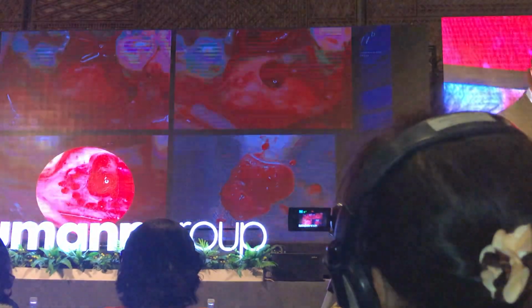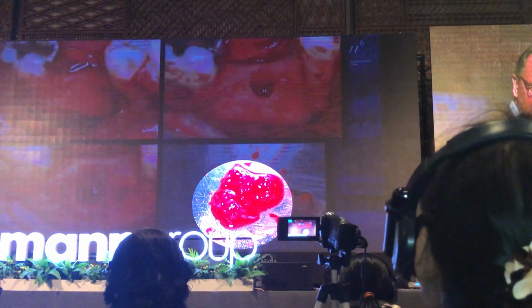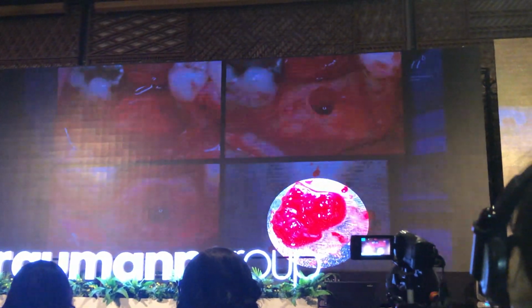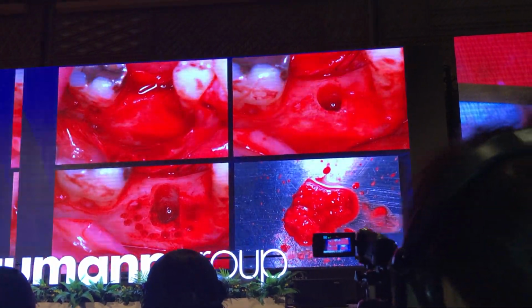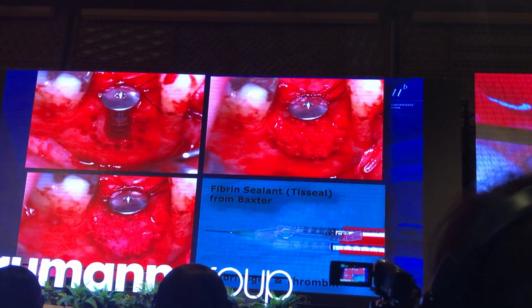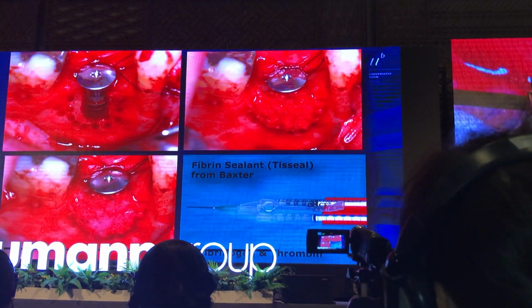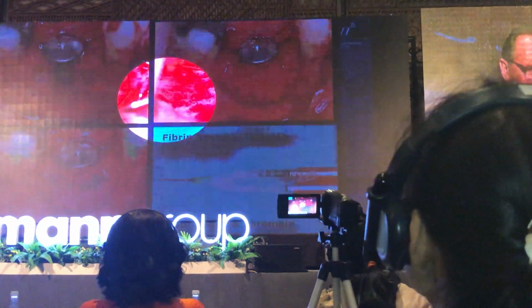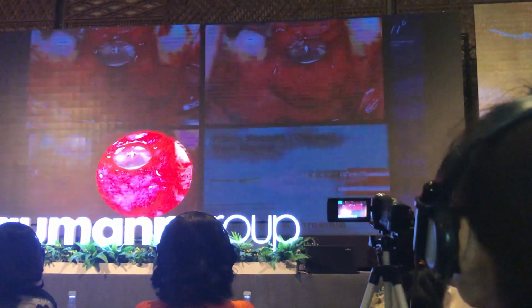And then we open up the marrow and perforate, like Swiss cheese. We take, of course, here in the back, autogenous bone chips. Very important. So you put an implant in and use the autogenous bone to the buccal to fill up that defect. That's what you see here. Healing cap on top, and you fill up the whole defect. This is the autogenous bone from the patient, from here. You move it 1 centimeter across. And then we stabilize it.